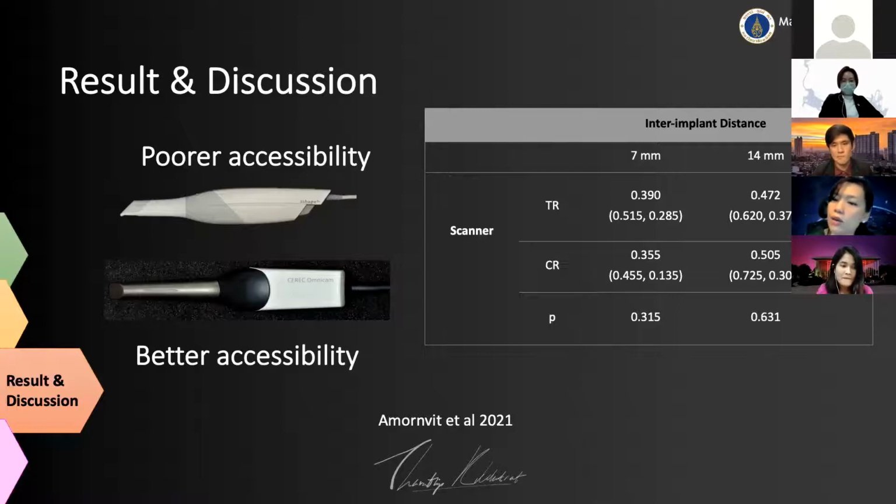Can I conclude that the intraoral scanner is actually more proper than impressions when we scan for single implants? In a single implant, there is another study that compared materials, conventional impression and intraoral scanner. There is not that much difference between using ideal conventional impression materials and an intraoral scanner. The ideal material includes PVS, silicone. It's not much different between using the intraoral scanner and silicone in a single crown impression.